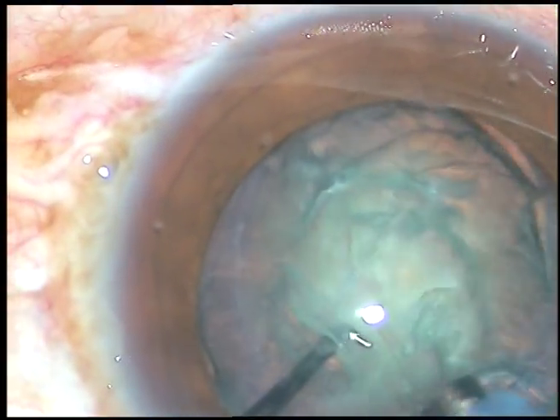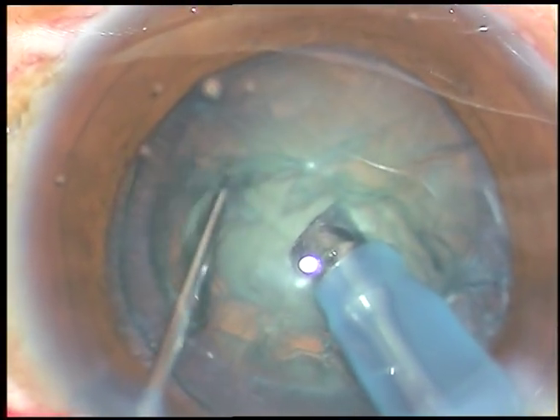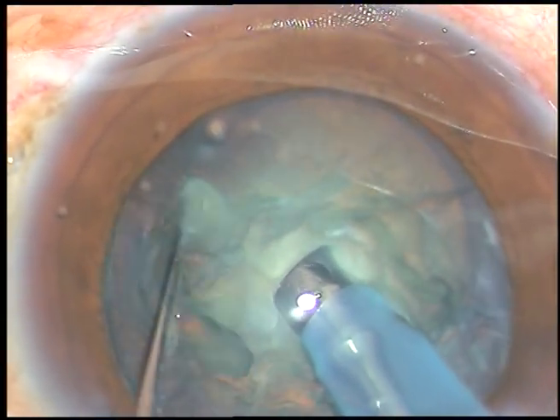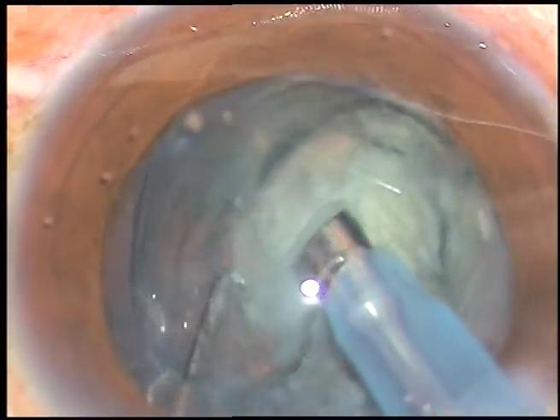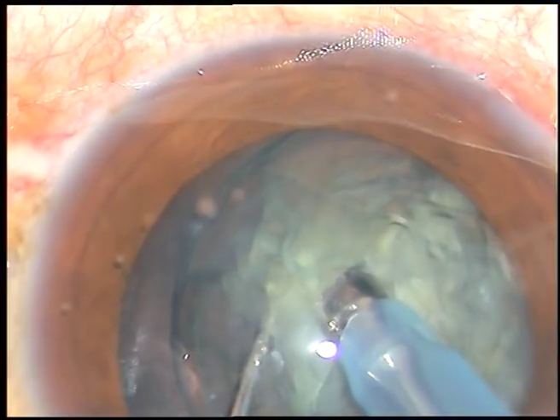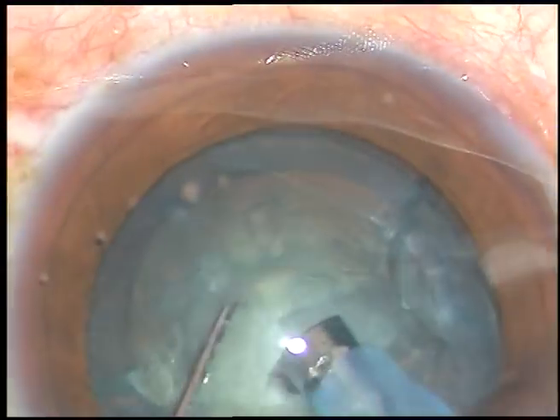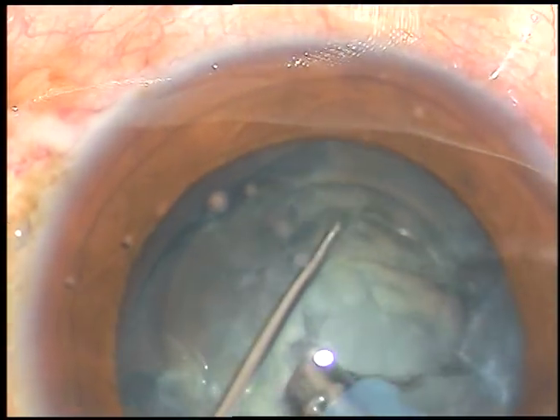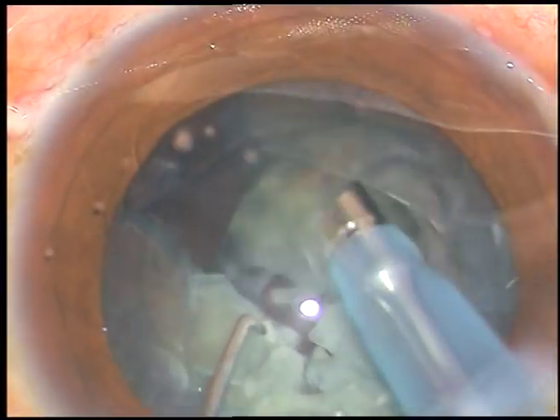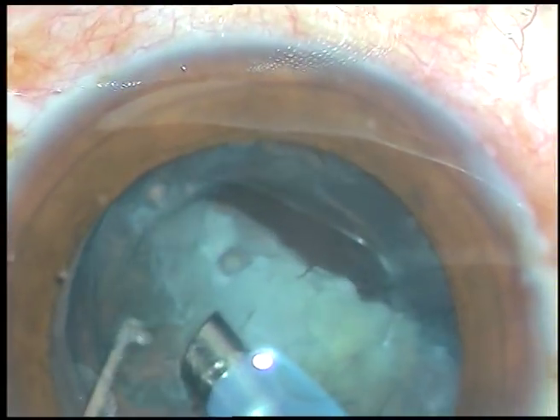Now this is direct chop. Bury the tip into the substance of the nucleus, hold the nucleus firmly and chop it like this, and separate the pieces. The nucleus has been divided into two halves. Now each half is again held with vacuum and chopped. This is the other hemi-nucleus — it is also divided into two pieces. Thus we have divided the nucleus into four fragments, and each fragment is now emulsified with ultrasonic energy and removed.